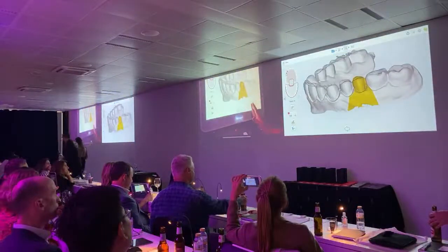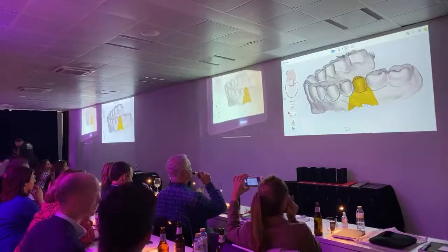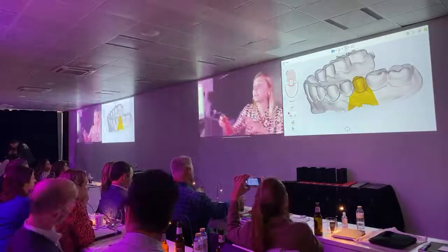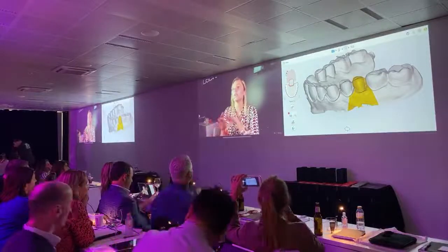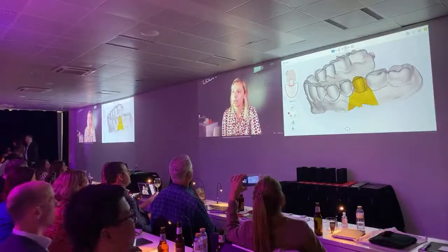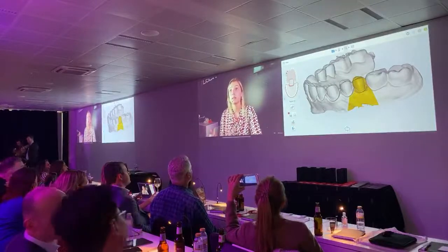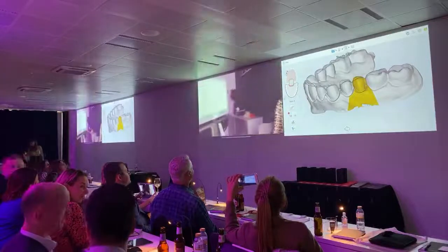You do it with every tooth. If you don't do it, even if you did the best technique, when the file goes to Angelo, we're gonna have overlap of images. It's not gonna be a very good scan, okay? Any questions?